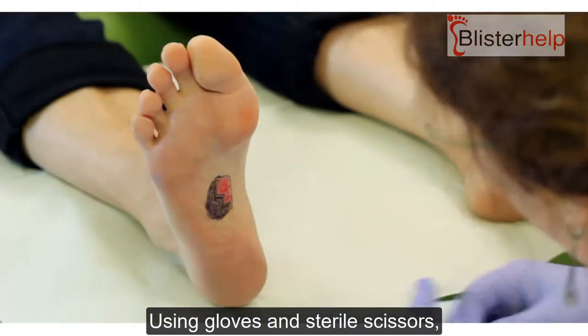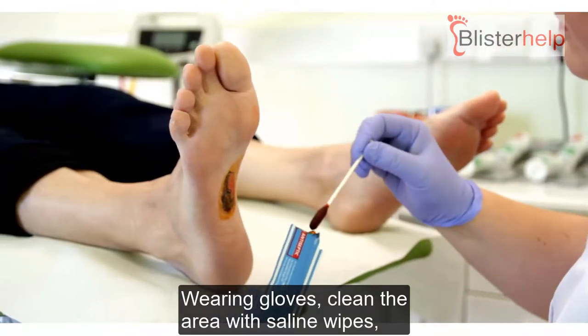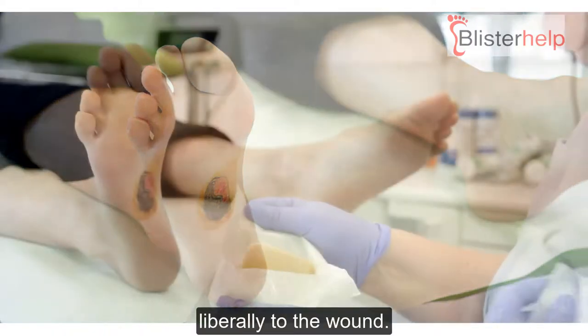Using gloves and sterile scissors, the dressing may need to be cut to size. Wearing gloves, clean the area with saline wipes and apply the povidone iodine or TCP sachets liberally to the wound.